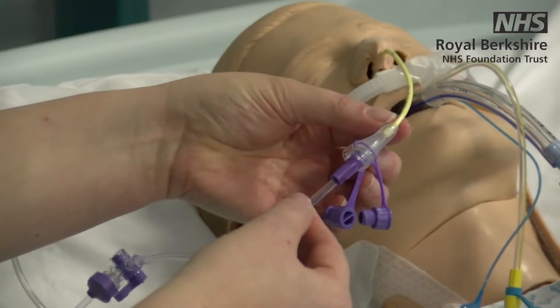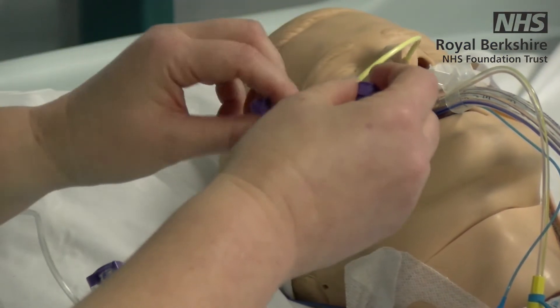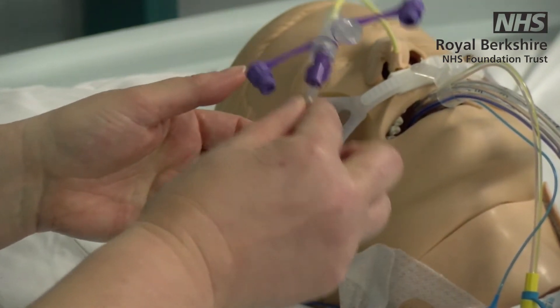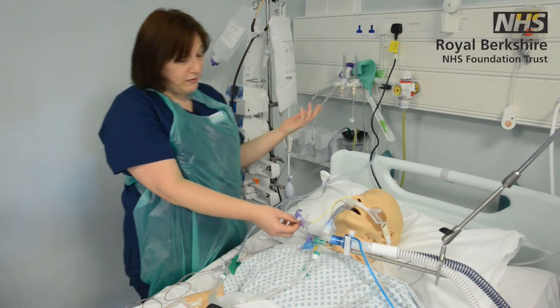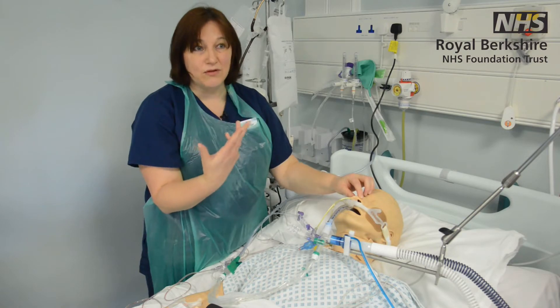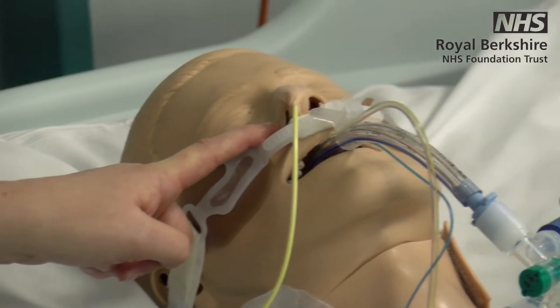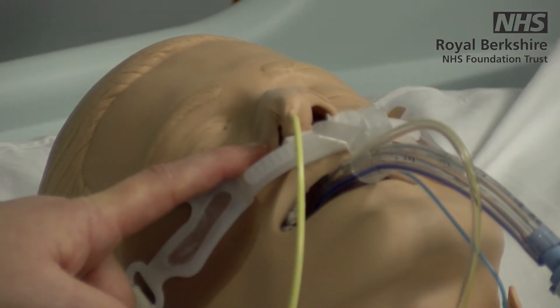We use fine-bore feeding tubes rather than a Ryles tube, and the make may vary slightly. For patient safety, the majority use purple syringes so you cannot connect standard IV syringes to the NG tube. Most of the time it will be connected to NG feed as you'd do on the ward. From a pressure care perspective, because the tube will be in for quite some time, be mindful of where it sits on the face — use appropriate tape and check regularly to ensure no pressure damage is occurring.